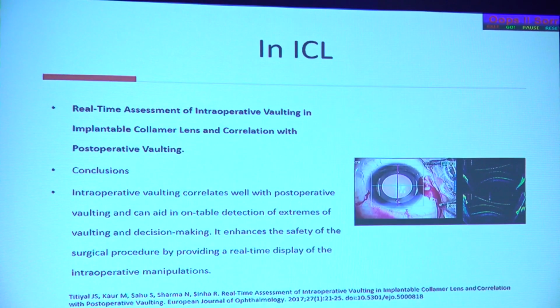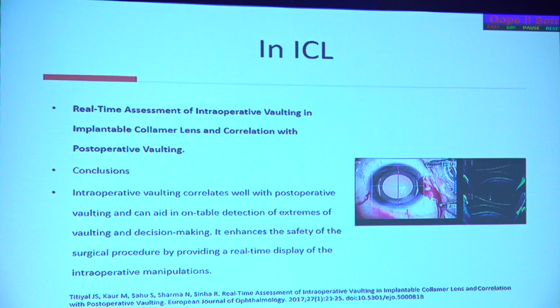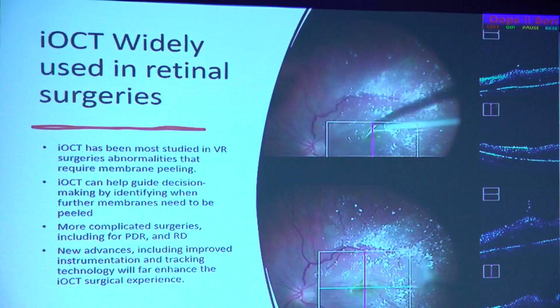The other thing I want to talk about is intraoperative OCT. So unfortunately, I personally do not have experience with the intraop OCT, but if you do have this technology, this is where it can help you. In case you're implanting an ICL, you can have a real-time imaging of what is happening. You can even measure the vault intraoperatively.